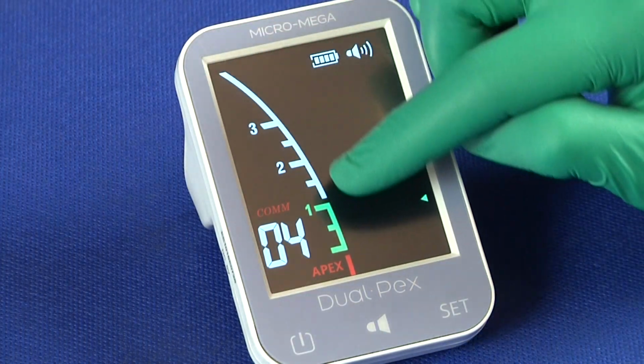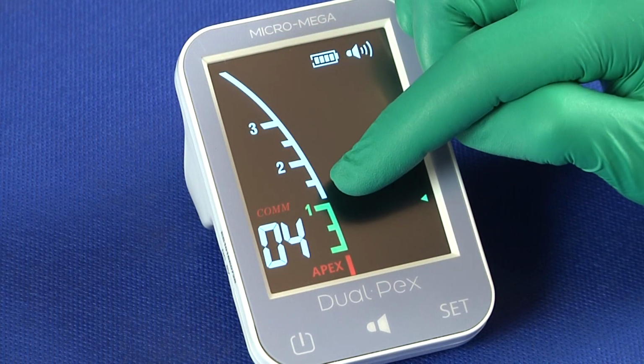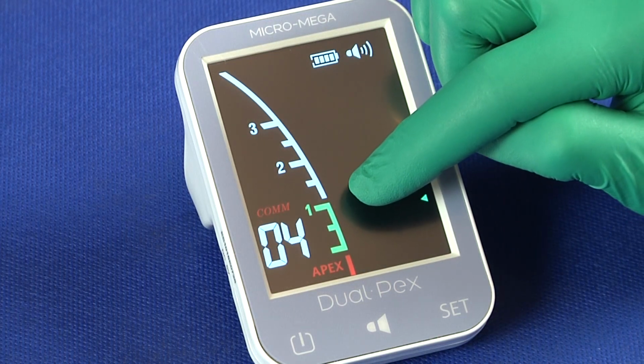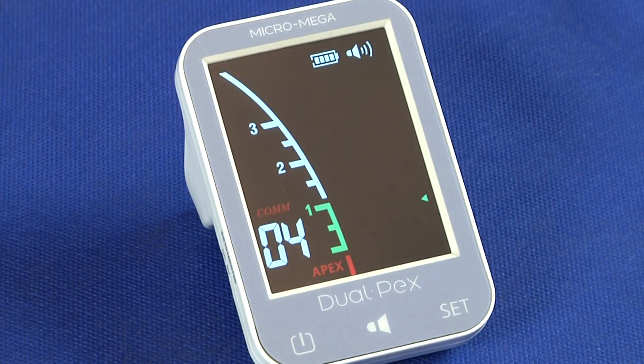The graphics on the display is a simplified view of the root canal, split into 3 different colored regions. The white part corresponds to the front region of the apical constriction. The green part symbolizes the apical zone, between the apical constriction, marker 1, and the apical foramen. The red part is beyond the apical foramen.